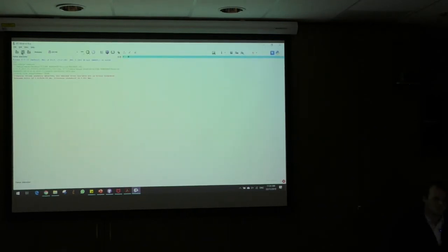Calibration CT data, you said it's provided by the 3D Slicer, but you cannot use ours if you want, for example? No. There is no option. Unless you get the open source software, the actual code itself, you can manipulate the code and implement your CT data set if that's what you prefer. At this point, though, there is no way to do it. There might be an extension function that allows you to do it, though. So, yes, thank you.